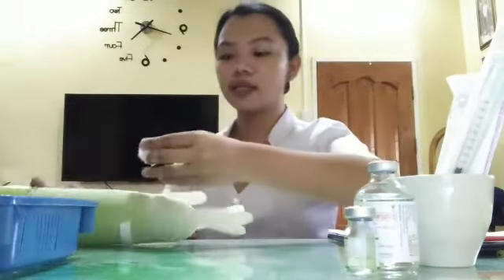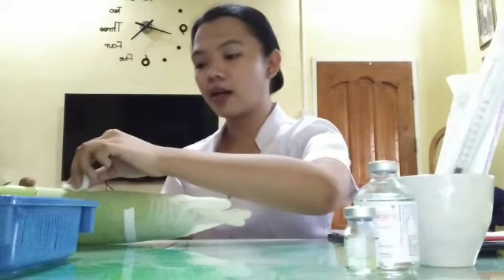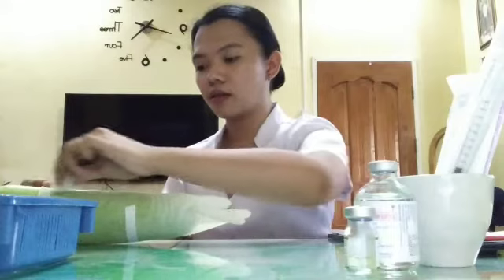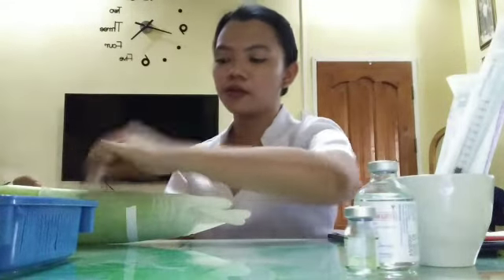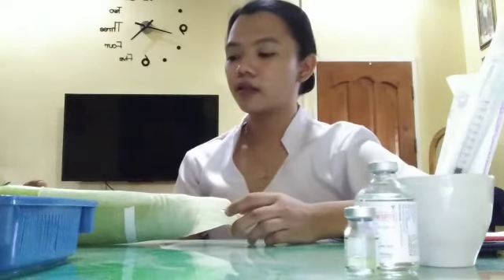So by cleaning the site, we will start from the center outward. Then we will discard the cotton, and then we will let it dry. Assuming that the alcohol is already dry.